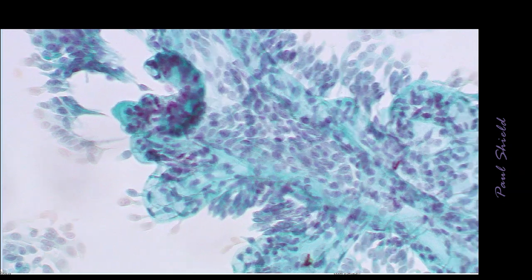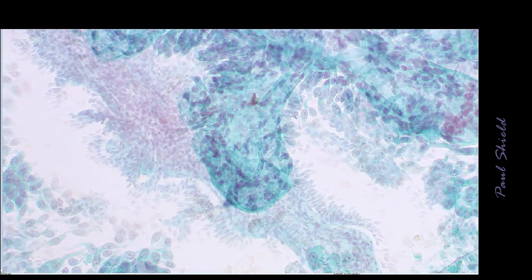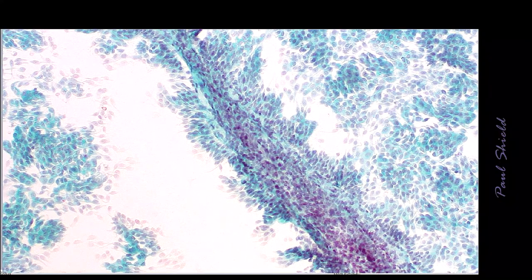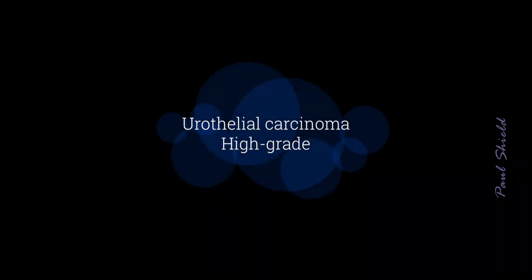And so because the epithelium lining these tumours is virtually benign in appearance, we really can't diagnose it unless we see these large groupings. So you can see this long strip here that's branching, has a fibrovascular core too, but notice the extreme cellularity of this specimen. So papillary lesions anywhere in the body are probably the most cellular specimens we see. Let's have a look at high grade.